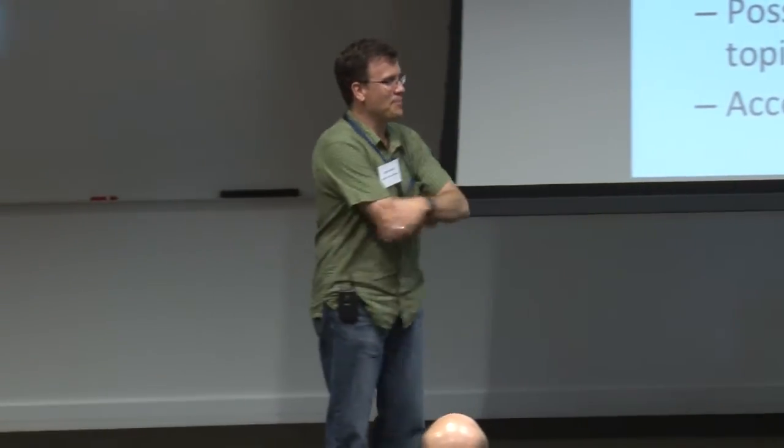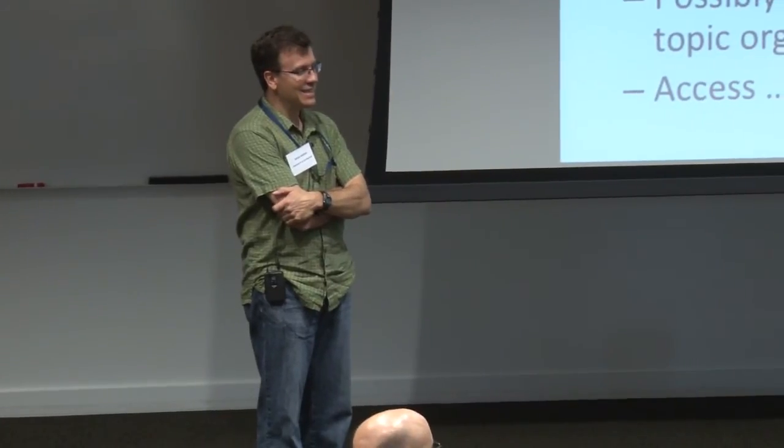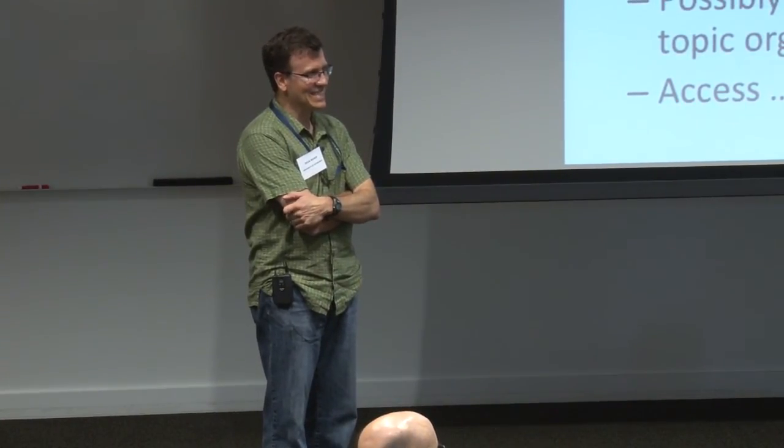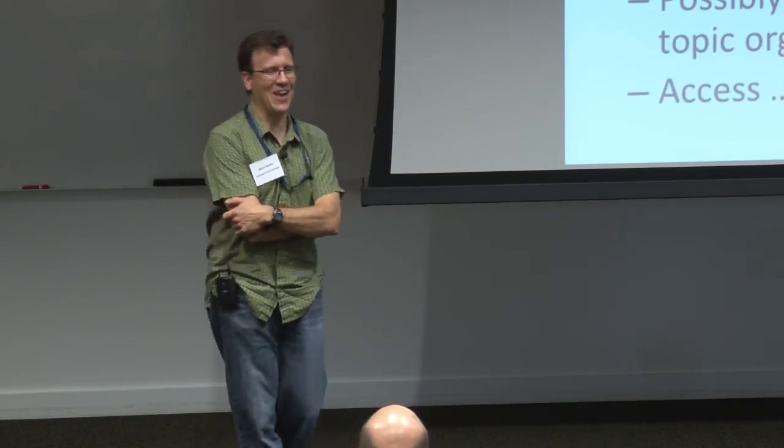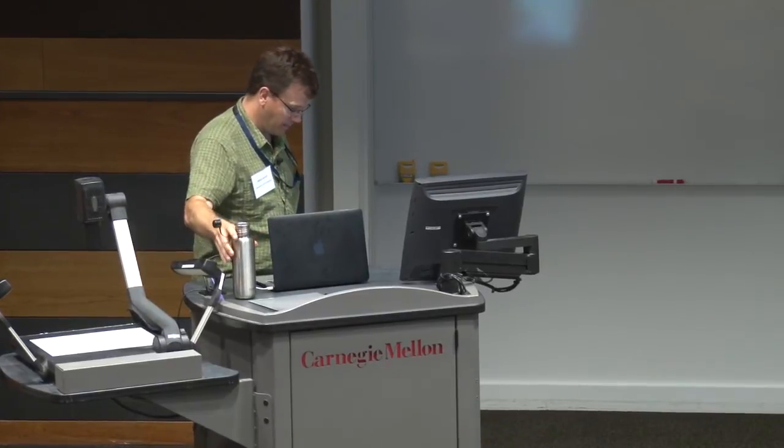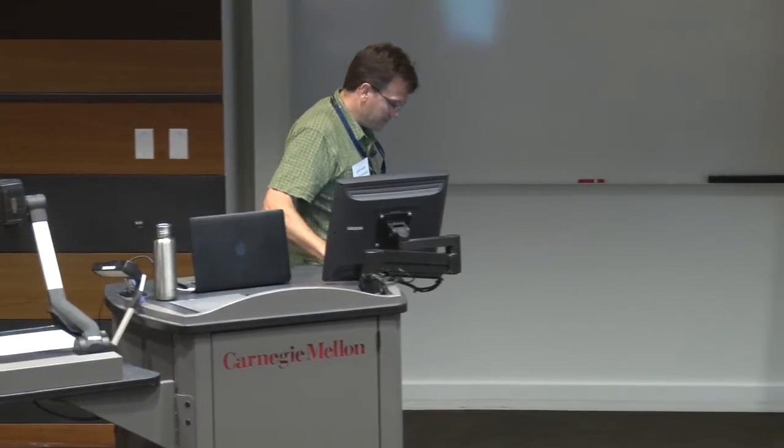I would like to just throw some cold water on that. Maybe I'm really talking about functional electrical stimulation. If I had a choice of an exoskeleton controlled by a computer versus an exoskeleton controlled by functional electrical stimulation, because it's so difficult to make sense of the neural signals, and they're delayed, I think I'm better off signaling high-level intent, you know, take me there, and letting the computer drive, than trying to control all the degrees of freedom. And I think that same argument applies here.